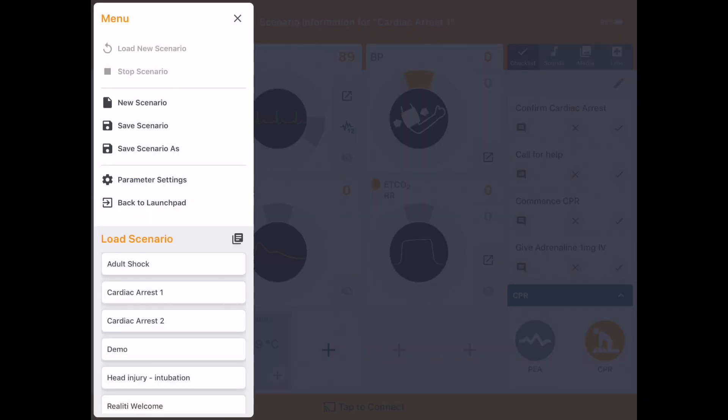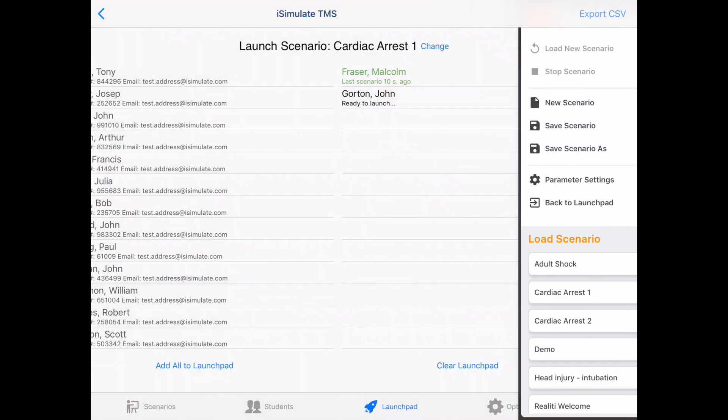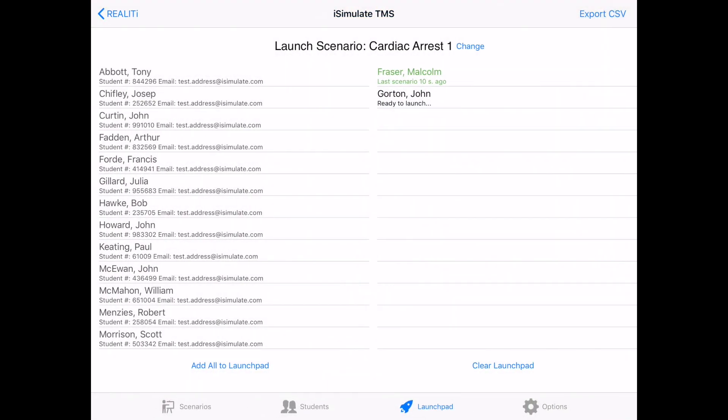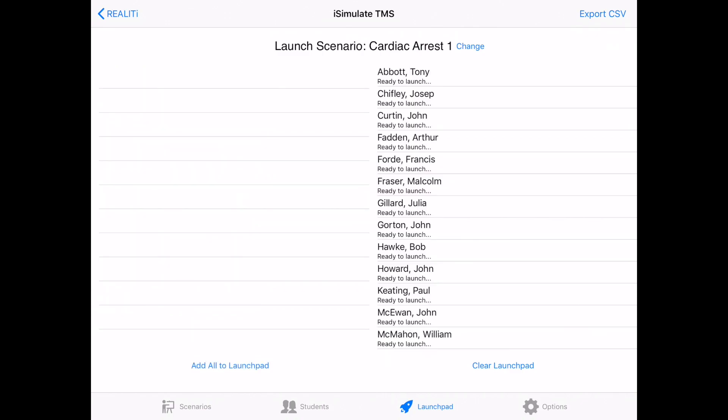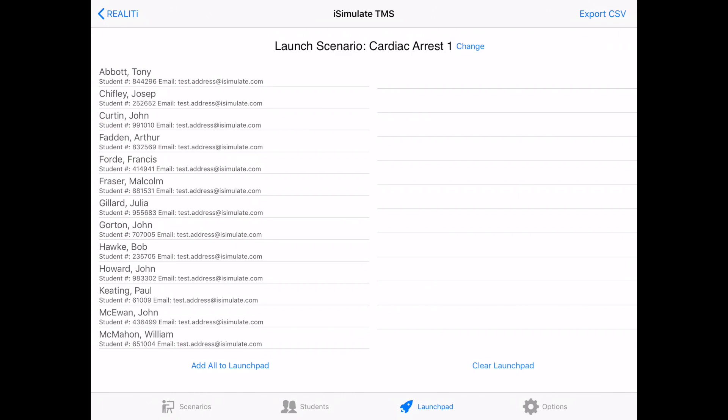At the end of the scenario, we can go back to launch pad and carry on with the next student. We can clear the launch pad quite easily by pressing clear launch pad. And we can add all the students to the launch pad as well. So this is really useful when you're running a course with multiple students doing multiple scenarios.